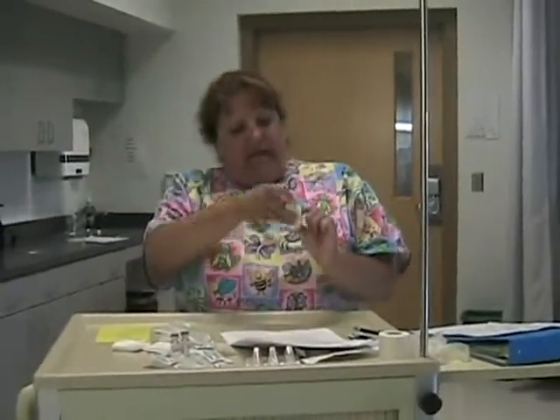Next, after verifying the allergies, you want to go ahead and read the MAR to make sure it is appropriate from the orders that you reviewed. Demerol 25 milligrams IM every 4 hours as needed for pain from a 5 to a 9 on the pain scale. Compare the label. Here's my medication. It does say Demerol 50 milligrams per 1 ml. Expiration date reads November 30th of 2011, so it is appropriate to go ahead and use that.